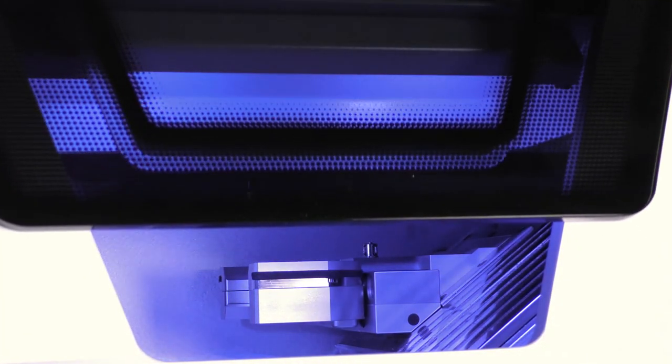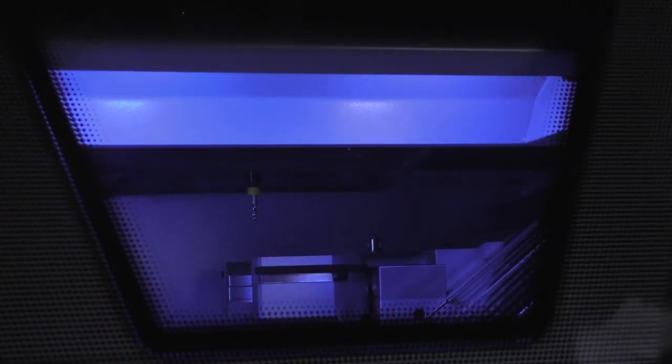Close the working chamber door and follow the on-screen guide until the drilling process starts. The machine drills the tool positions into the inserts. Dental CNC shows the progress in the drill tool magazine inserts window.